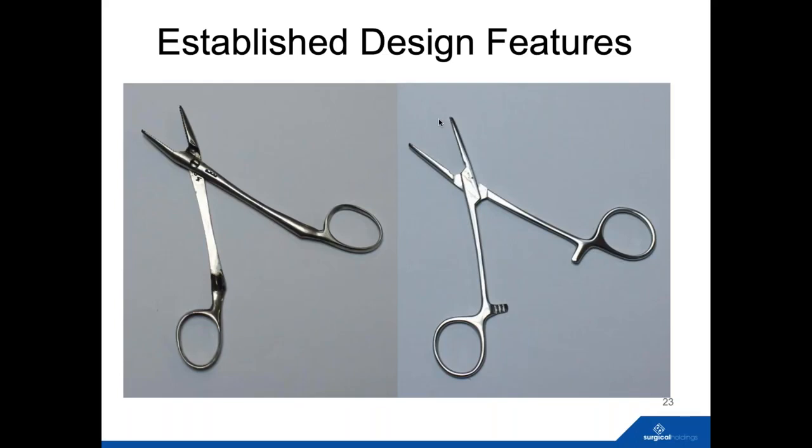Interestingly, the one on the left probably nowadays would be easier to clean because you can actually take it apart. And indeed the rack is protected from damage because it's internal to the device. So some things modernized, but maybe not always for the better. But of course we know that box joints are used on a very high percentage of instruments nowadays.